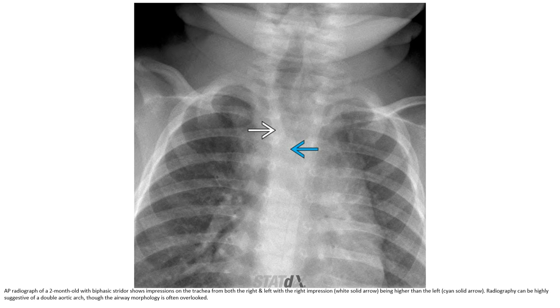The AP radiograph will show bilateral impression on the trachea from both the right and the left, with the right impression being higher than the left. The radiograph can be highly suggestive of a double aortic arch, though the airway morphology is often overlooked.